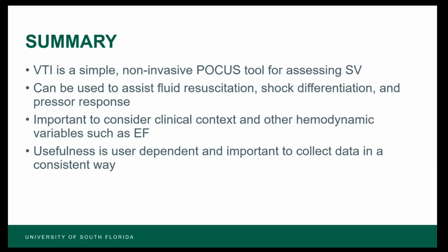So lastly, to go back over everything in summary, VTI is a really easy way that you can use at bedside to assess your stroke volume. You just grab an ultrasound probe and place it on your patient, knowing that you have to get pretty accurate measurements, and that gets impacted by the way your patient is lying, the way the patient is behaving, and the cardiac views seen on POCUS, depending on the windows you can obtain at bedside. Those are some caveats to remember when obtaining your VTI.